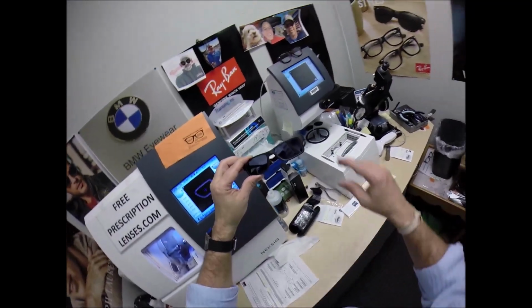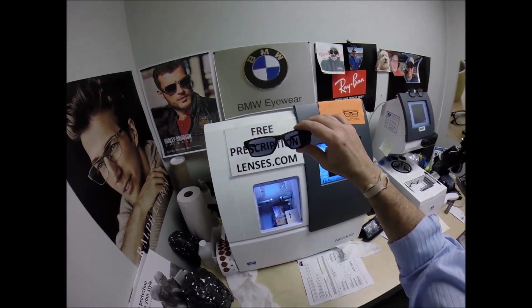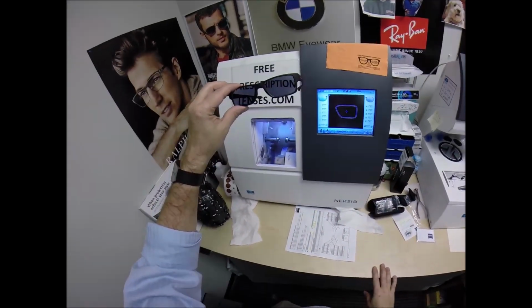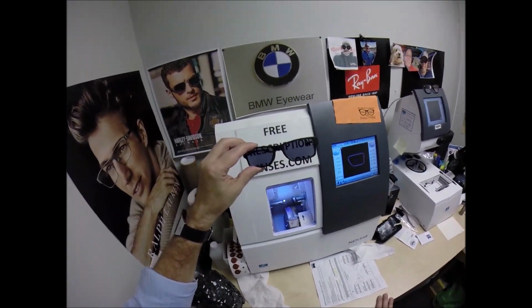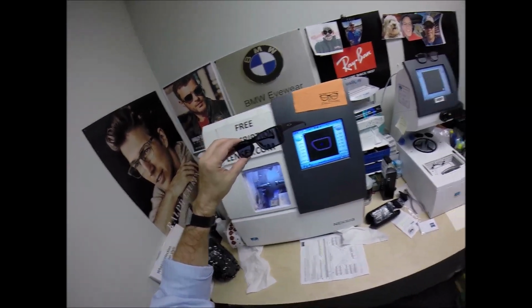All photochromic transition lenses are temperature sensitive, meaning they will get darker when it's 85 and below than they will when it's 95 and above. But I remind everyone, when it's 100 degrees outside, you're miserable, they're miserable. Nobody works 100% when it's 100 degrees outside. We all work much better when it cools off.